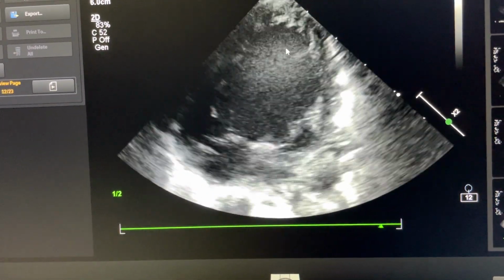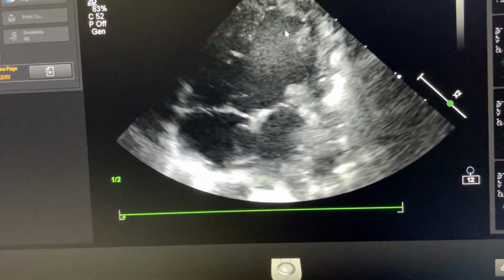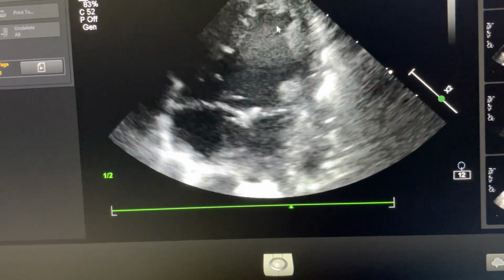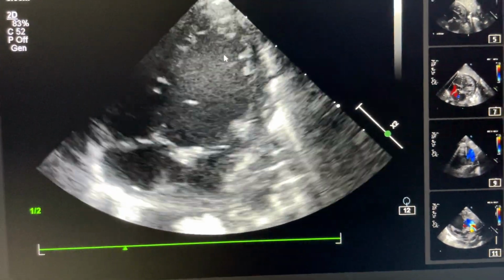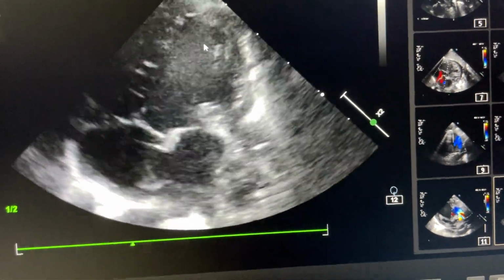So this case has only a single ventricle, and the right ventricle outlet portion is seen when we see how the pulmonary artery arises from that ventricle. Then only the right ventricle outlet portion will be seen with a large VSD, so ultimately it looks like a case of single ventricle.